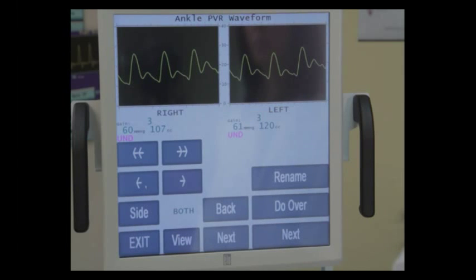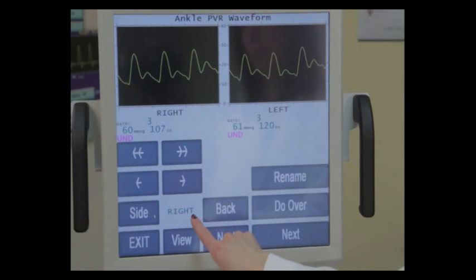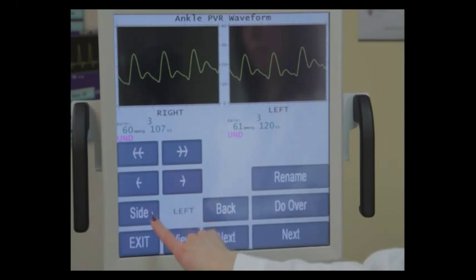Now, using the side button beneath the slow scroll button, we can scroll both at the same time. If we press side once, it'll then go to the right side where we can scroll the right waveform individually, and if we press the side button again, it will now toggle to the left where we can scroll the left waveform independently. Once the waveform looks good, press the next key.